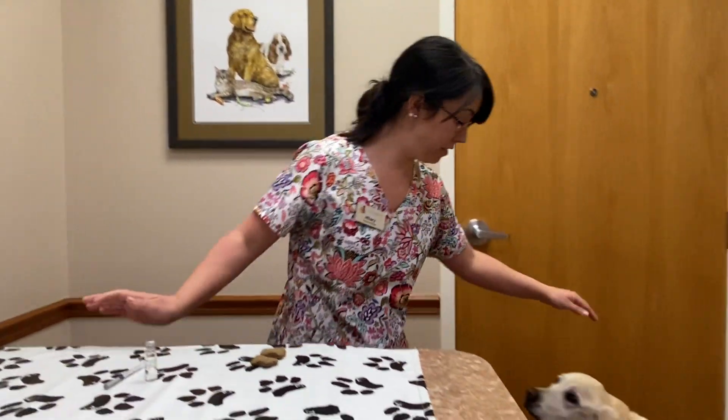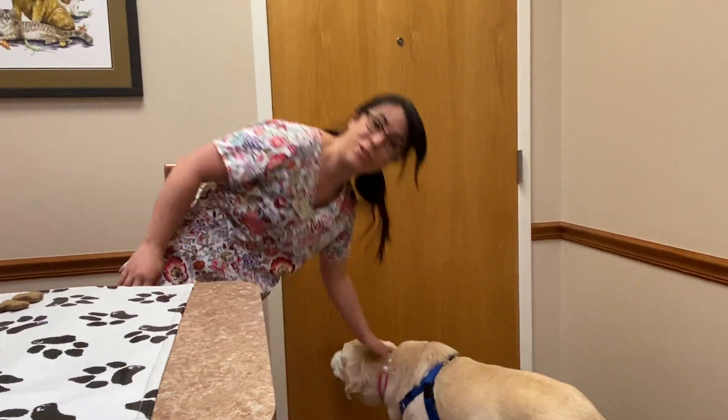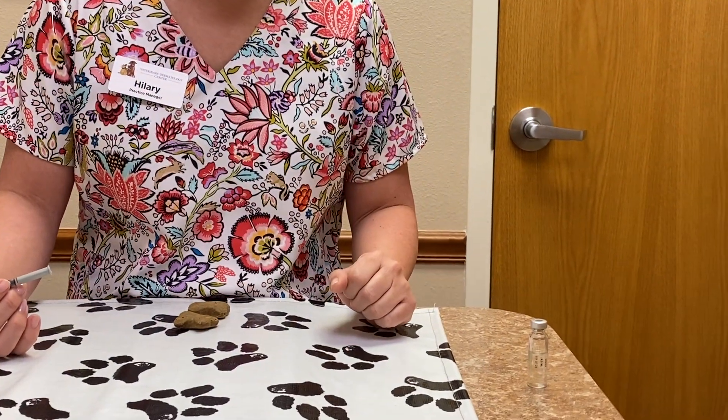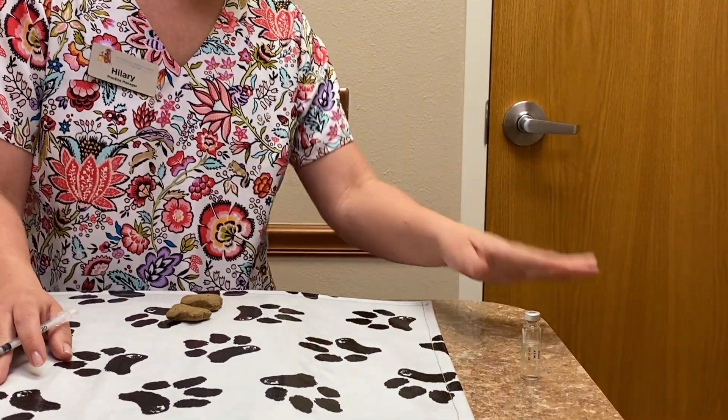This is Dakota, and she's going to help us show you how to give an injection today. When drawing up your vaccine, you'll have your three little glass vials. I strongly recommend you draw up your vaccine, put it away in the refrigerator, and then call your dog over to give the vaccine. The last thing you want is your glass vial sitting on the edge of the table — things get a little exciting and you knock it over.